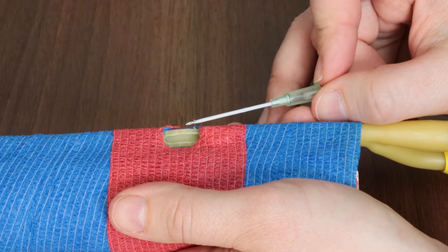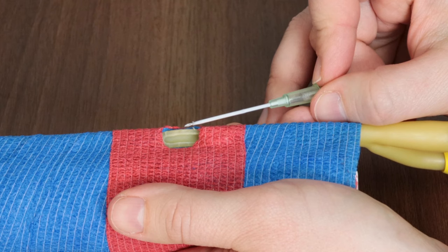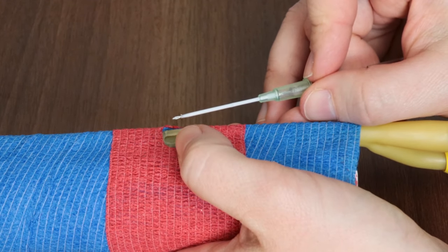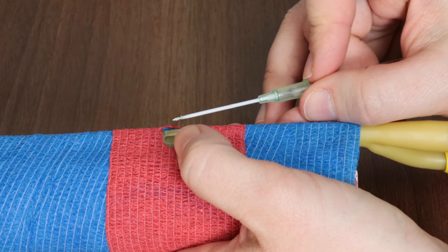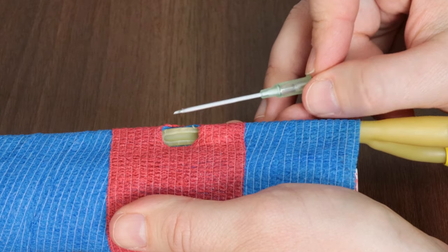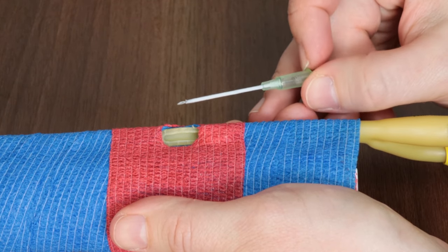Let's get started with the decrease of angle that I mentioned during the catheter placement. Notice on our IV catheter stylet here, there is the beveled edge, just like you would see on any other regular needle. And the beveled edge should be up anytime we're placing an IV catheter.